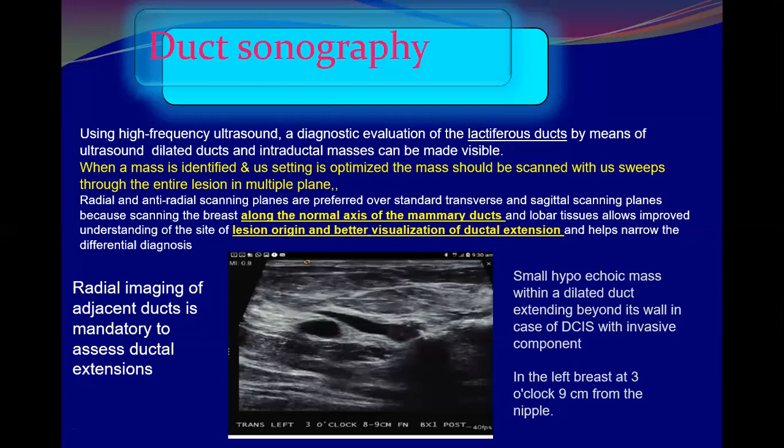But generally, as a rule, we have to consider radial scanning for the duct. It is mandatory to scan the duct with a radial technique.